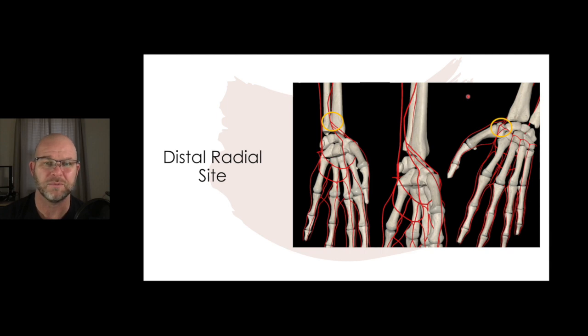Another approach that different places will use is this distal radial. Here we see your primary site, that ventral approach. But where it actually comes back up over the wrist, if you went left radial and everybody's on your right side during your procedure, that patient can put their hand over top and just lay it instead of having their wrist turned. They can lay their hand very comfortably, and you can access that in the snuff box. That's called a distal radial approach.